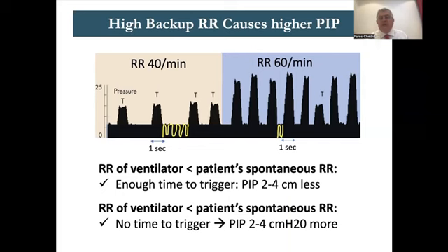The patient, even if he's awake and wants to trigger, will not be able to trigger because you put the rate very high. There's no space between the two breaths to trigger. So what I suggest is that you look at the spontaneous breath and the ventilator breath. The patient should be awake enough to trigger, and the spontaneous breathing should be 10 to 20 per minute above the ventilator breathing. So if the patient is breathing 60 per minute, put the ventilator at 50 per minute.